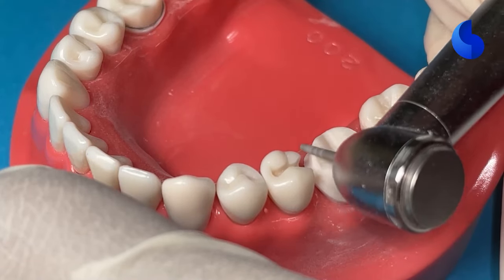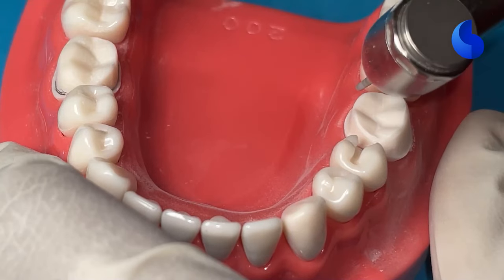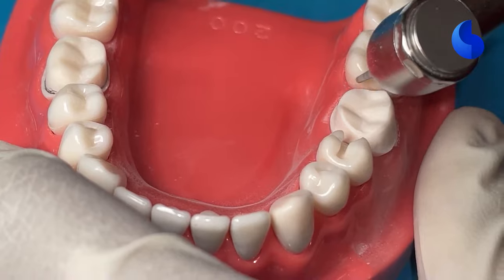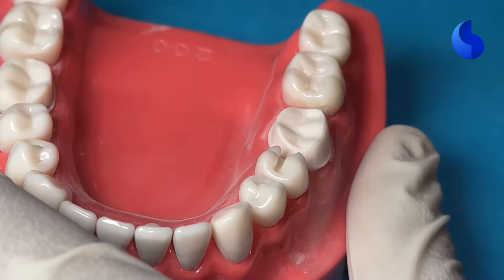You don't want any sharp edges in your tooth preparation. It's not something that is clinically accepted, so it's not something that they would expect from you, even in an exam. So make sure that there's nothing sharp, nothing pointy. All the point and line angles are completely round.